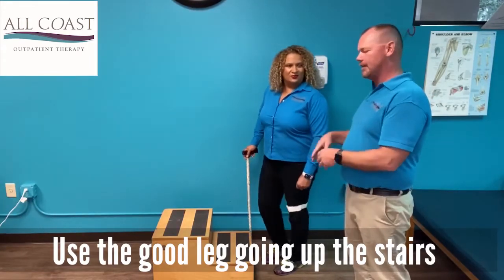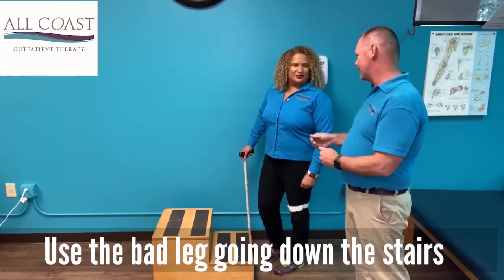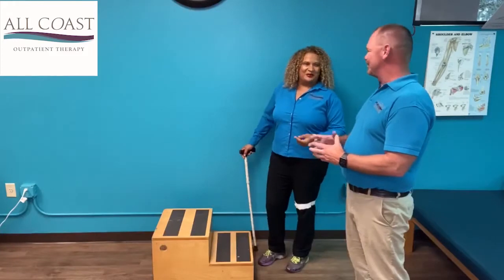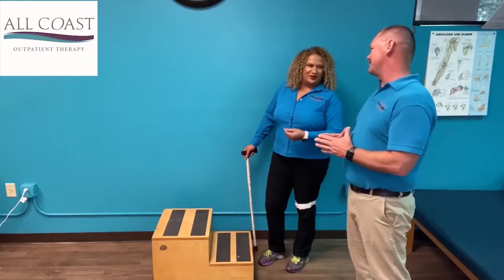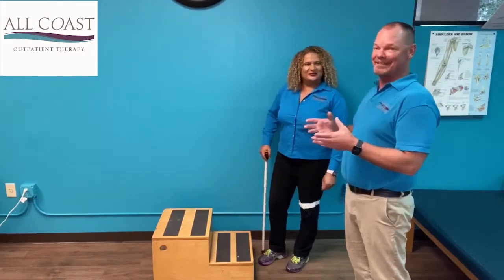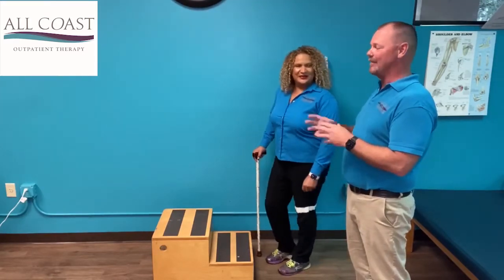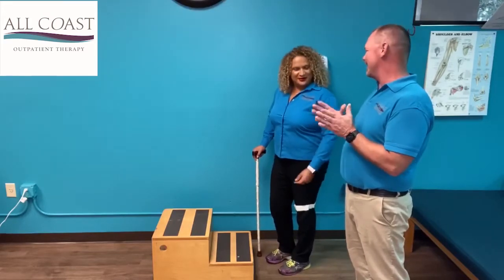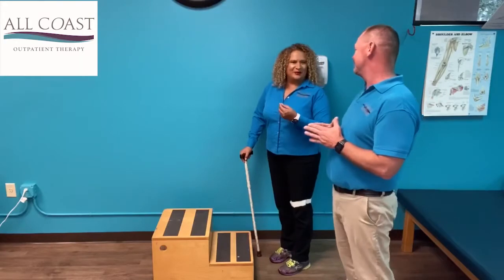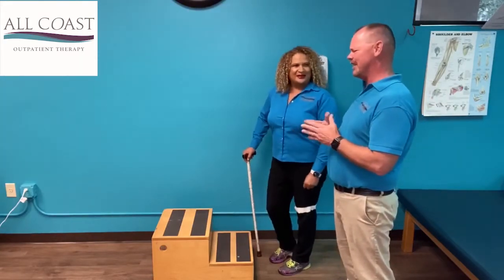And as you're going down the steps, it means the bad go to hell — so you lead with your bad leg. What about just saying 'going up with the good leg and down with the bad leg'? It sometimes doesn't stick. If you remember that saying, it's very easy. A lot of therapists say 'good leg goes up and then down with the bad leg' — but 'good legs go to heaven' is a useful way to remember.